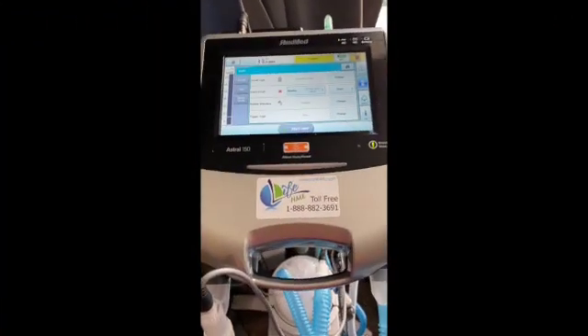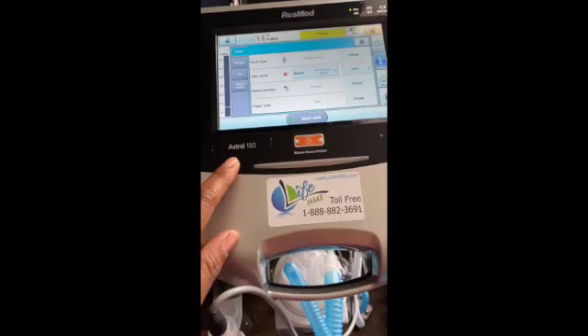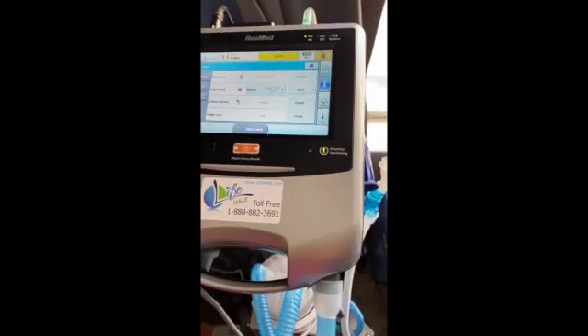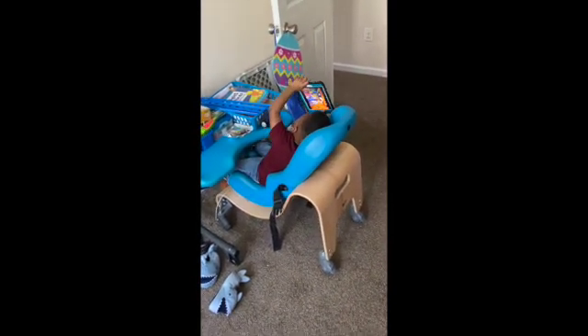Hey everybody, a lot of people have been asking me to do a video about doing a learn circuit on the Astral vent. This is the Astral 150 right here. This is Braylon's vent — Braylon is currently at his table with his iPad doing his trach collar trial, so he's not on the vent right now. I thought this was the best opportunity to do this video.